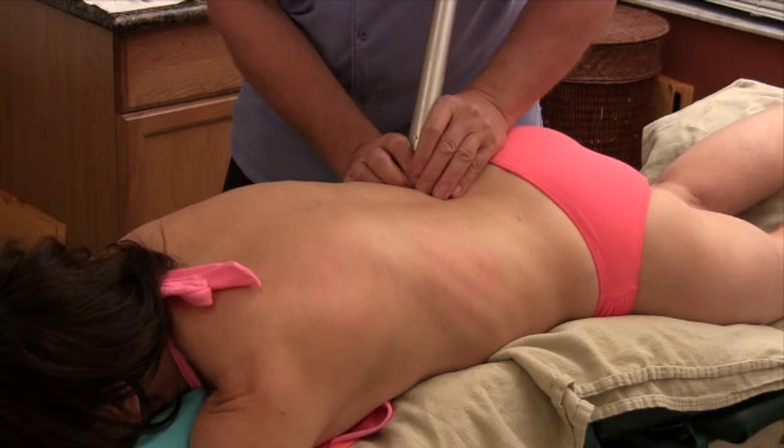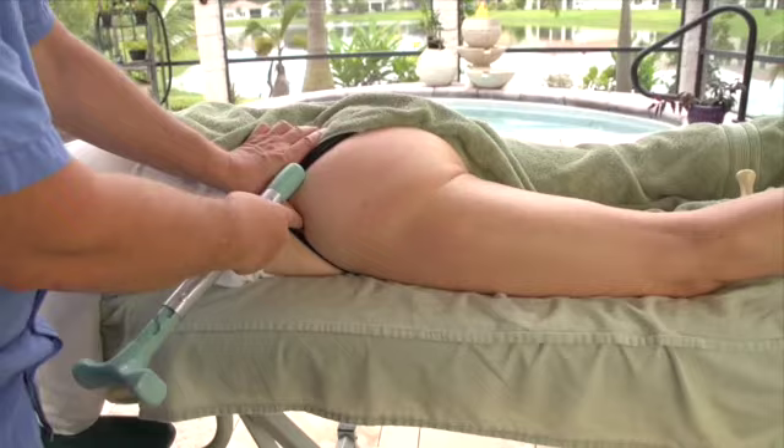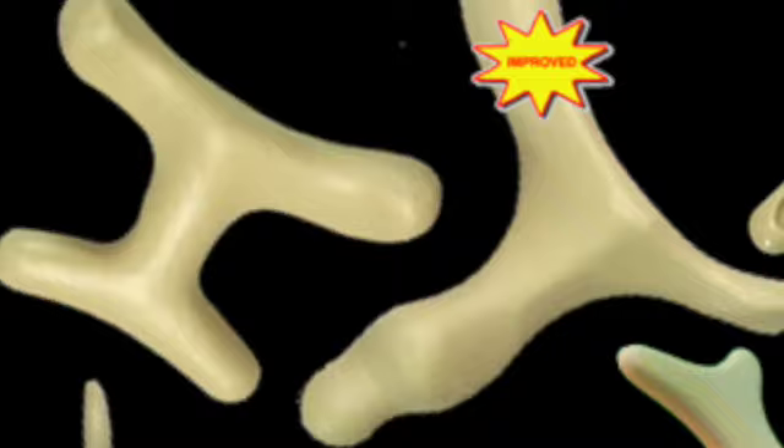The tool is right there along the spinous processes, and by just putting a little of my body weight on her... I'm keeping my fingers right on those spinous processes and my thumb right on the crest of her ilium. So using the best friend tool with the round tip — I've put the tool against my tummy and have the tool right into that.